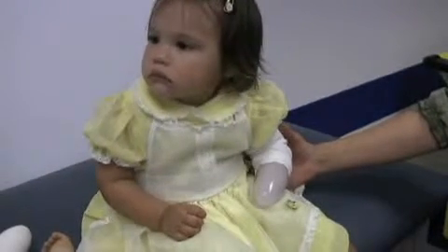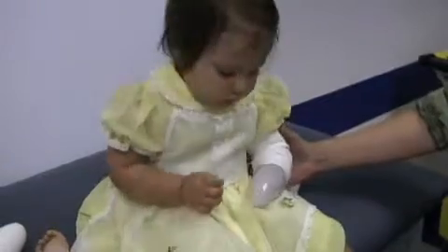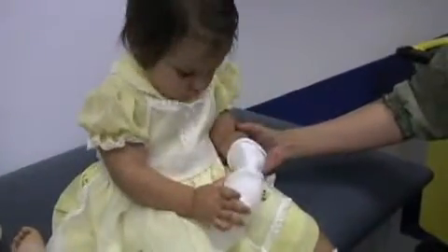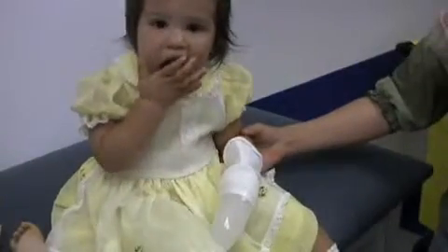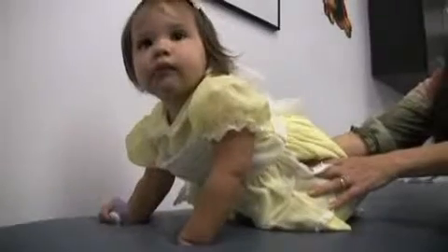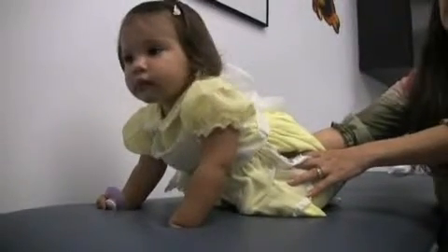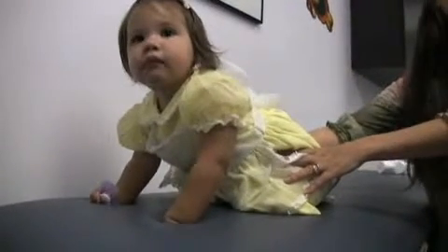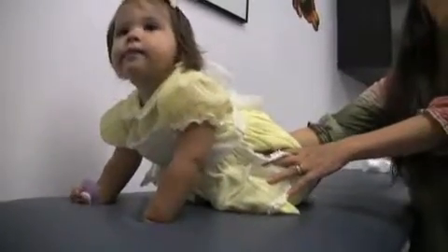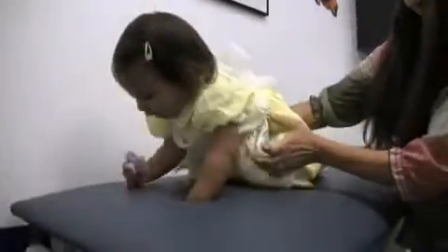Yeah, over the weekend we'll do that — a little bit by a little bit. That's the longest she's had it on, so that's good. And she's not crying. She does a lot with her little wrist. She's really good at opening doors and taking out all the lotions.